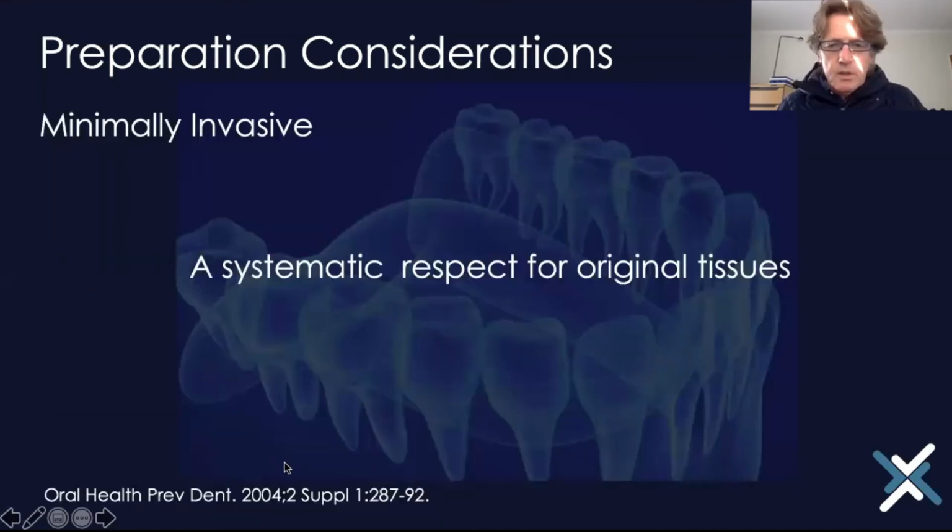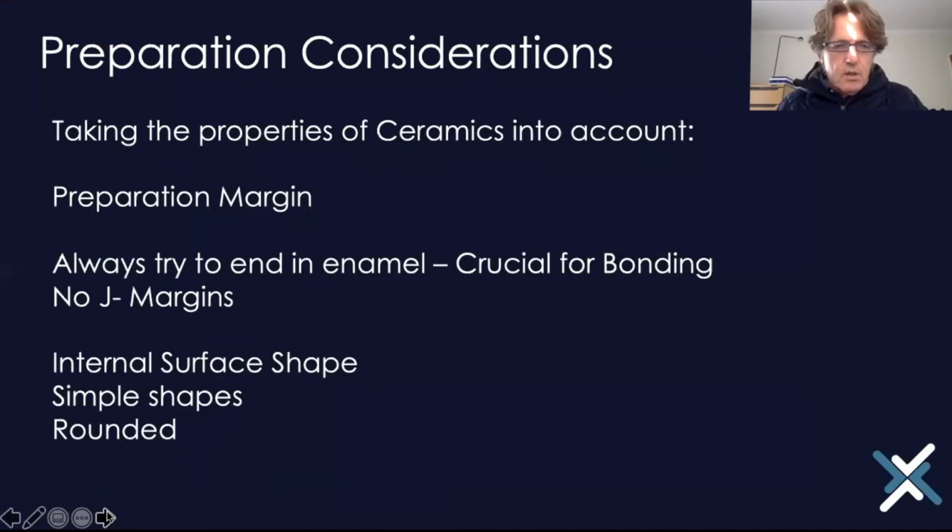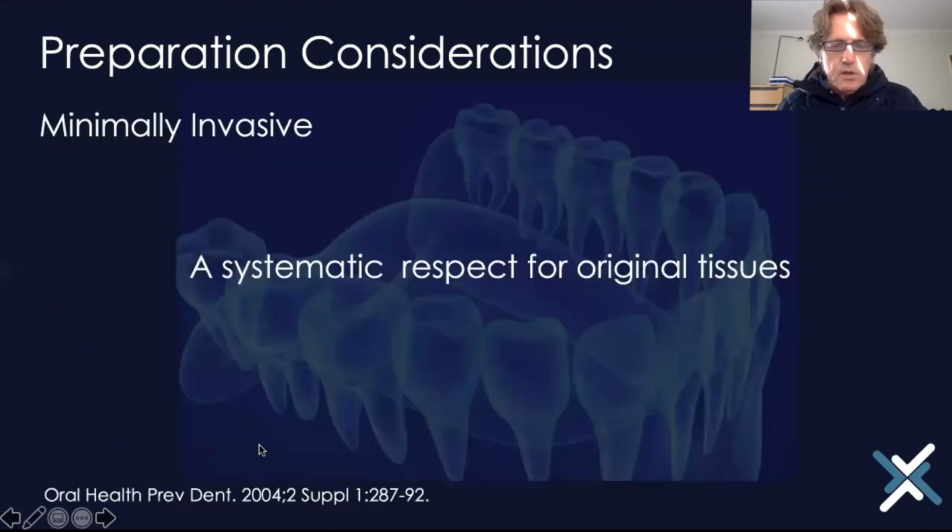There's one that missed here. All right, sorry guys, I note there's a slide not here, but the next slide says adequately prepared, and adequately prepared only says that you have to remove enough tissue so that you can provide the patient with a successful prosthodontic follow-up. In other words, that you can create a proper restoration once you have prepared.